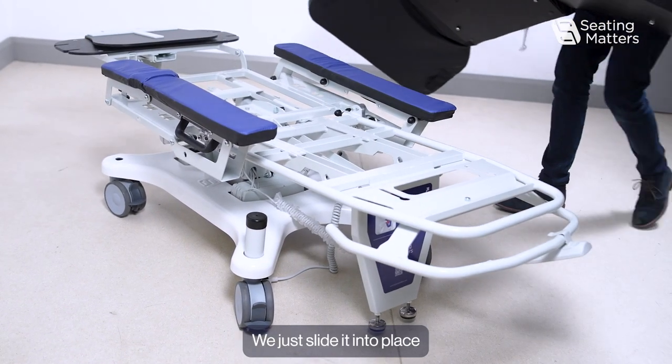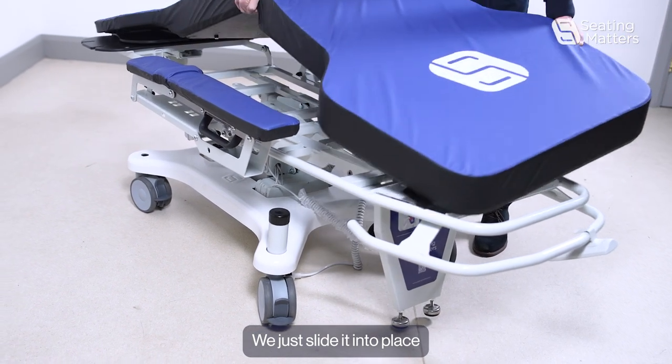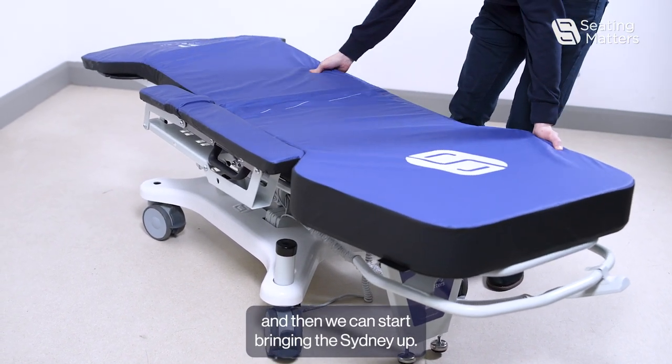To put the new mattress on, we just slide it into place and then we can start bringing the Sydney up.